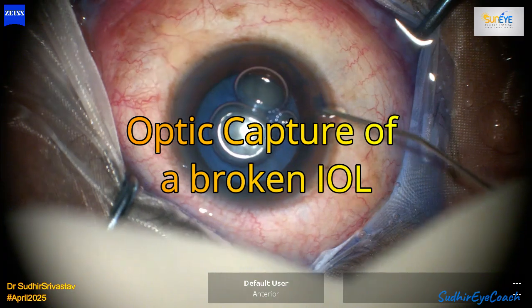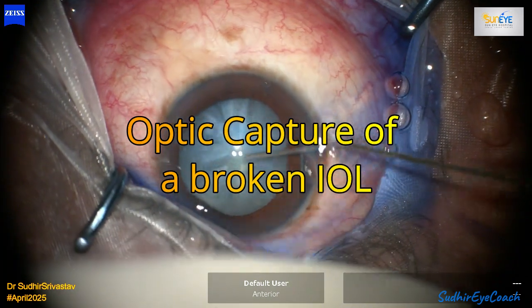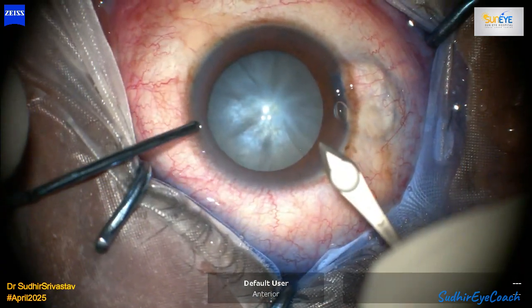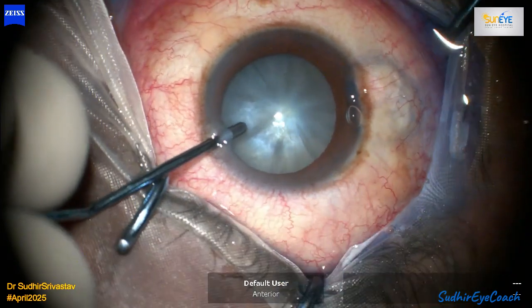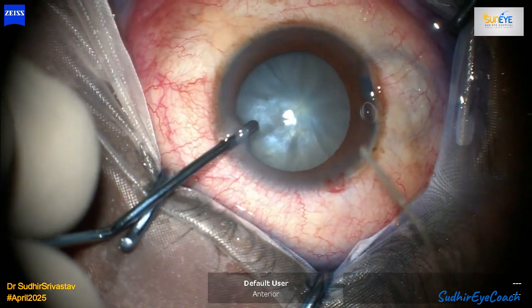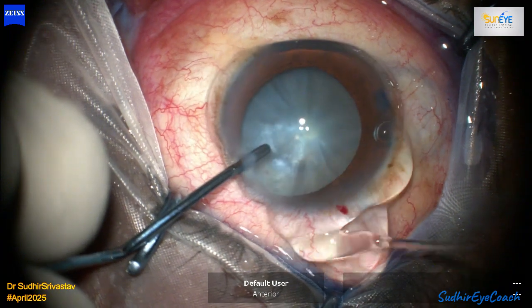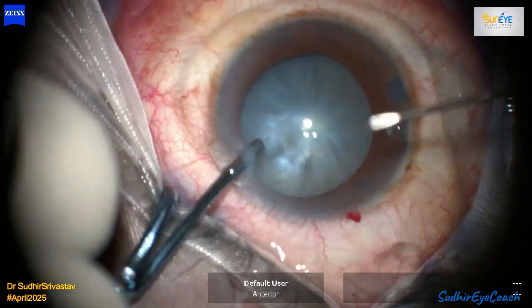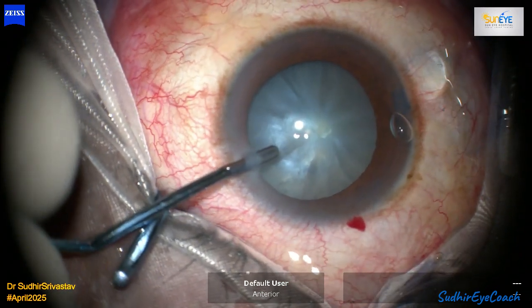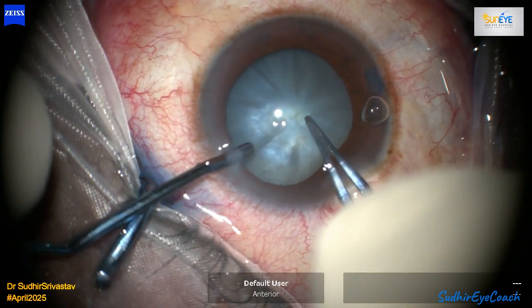My usual approach in such cases is to begin with a small controlled baby capsulorhexis, then decompress the lens using an IA cannula by milking with the blunt cannula on the anterior capsule. After decompression, I make a nick in the capsule to access and enlarge it to a moderate size through which I can perform safe and easy phaco fragmentation.